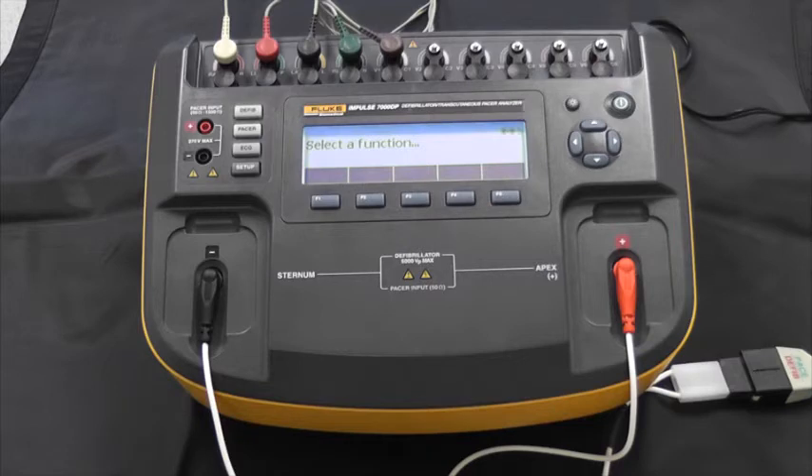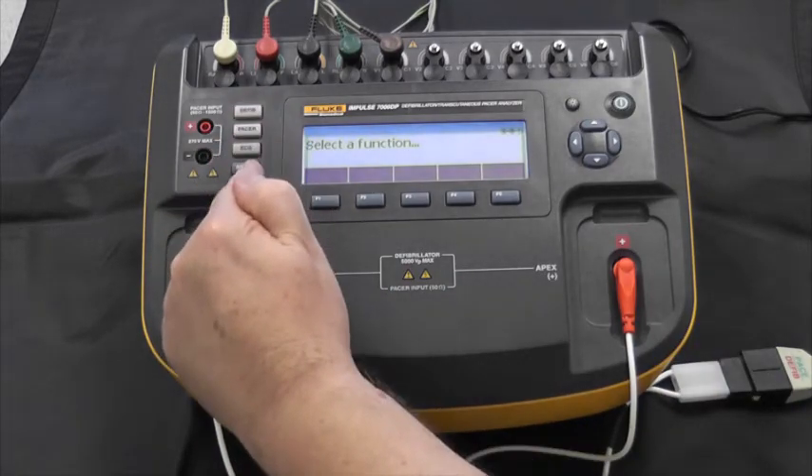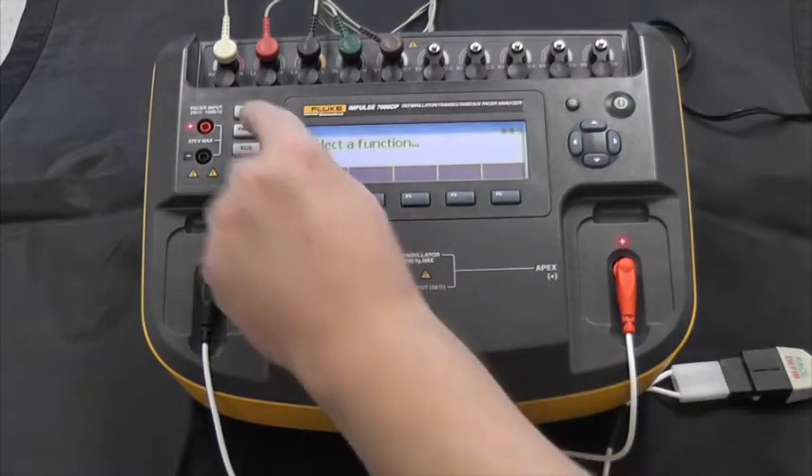So how do we select what we want to do? You can see on screen it says 'select a function' — in other words, tell me what to do. We follow the function keys on this side of the screen. So let's start with defib.